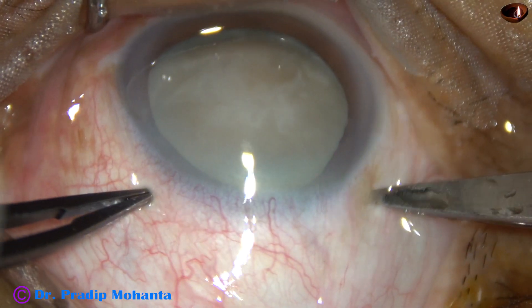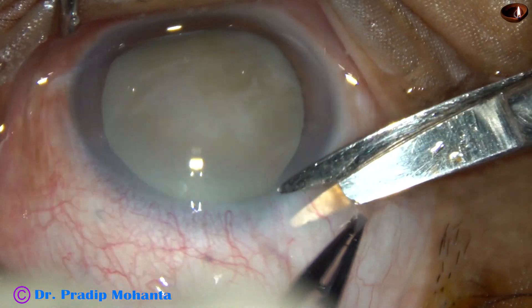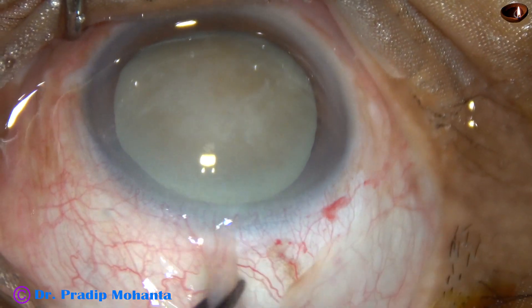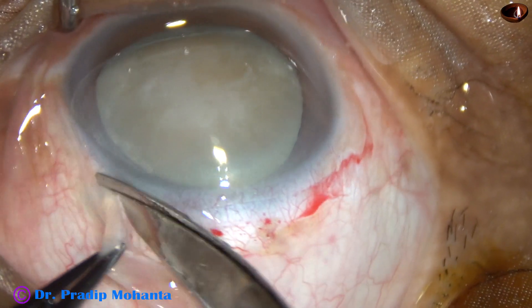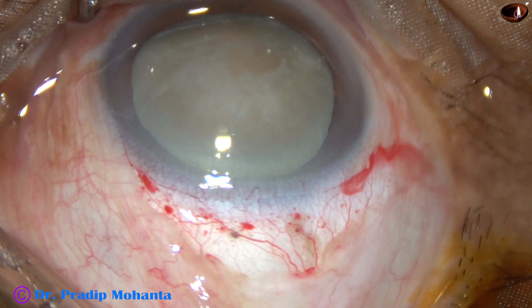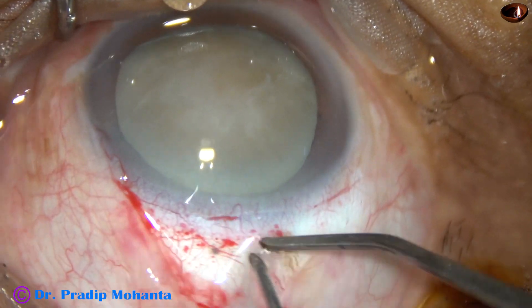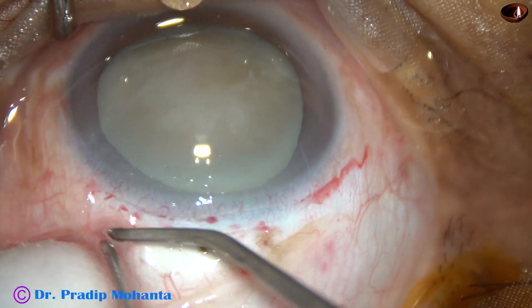Superior rectus bridal suture has been applied. Now conjunctival peritomy for about 4 clock hours, from 10 o'clock to 2 o'clock. We are going to do Large Incision Cataract Surgery in this case. If you learn this, you will never have a problem with hard brown or black cataracts, and you need only just one suture.